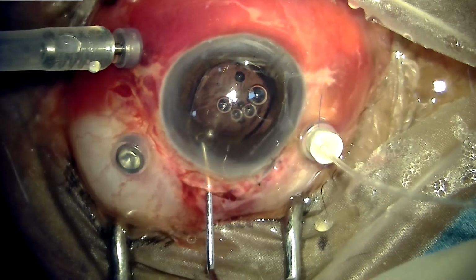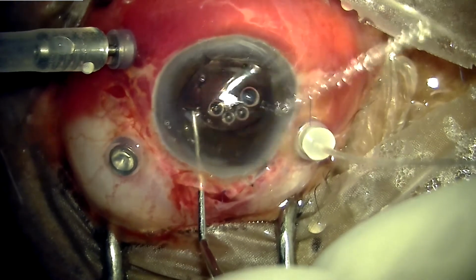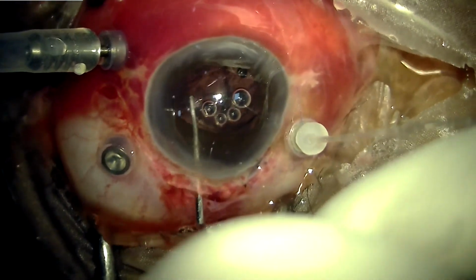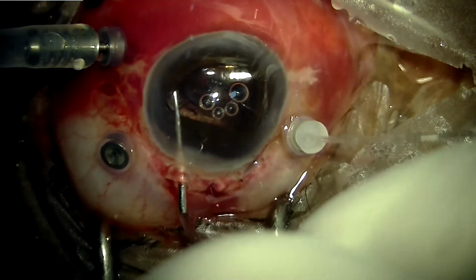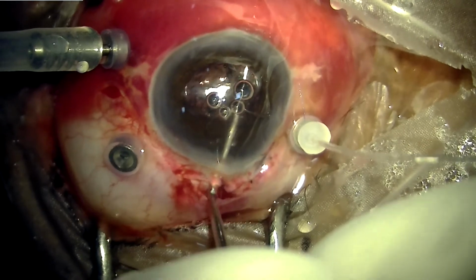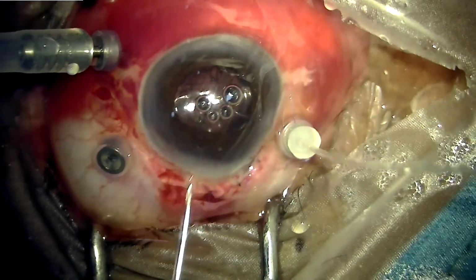So this is a single piece hydrophobic IOL which I have been using for implanting in the sulcus, though this may not be in agreement with a majority of consensus, but I have found these working well for these eyes and they don't cause any problems as mentioned by a few people.